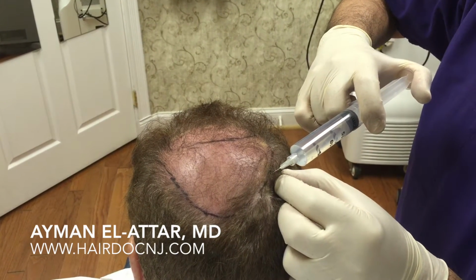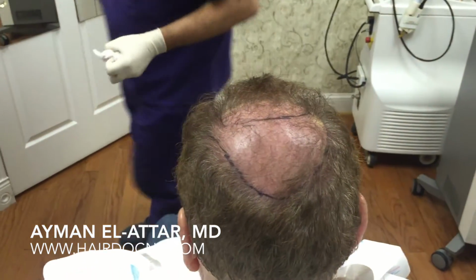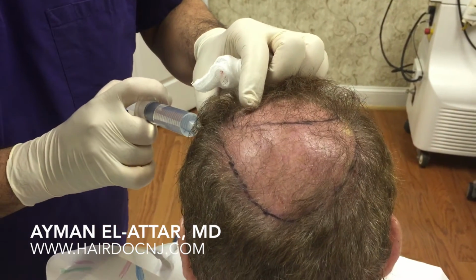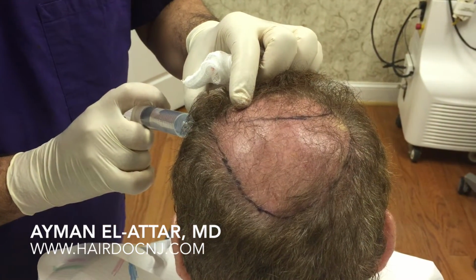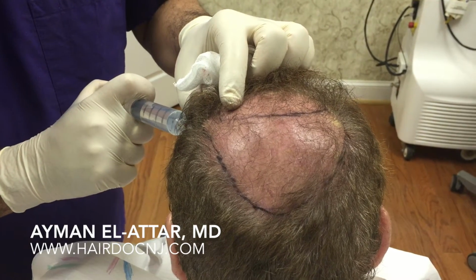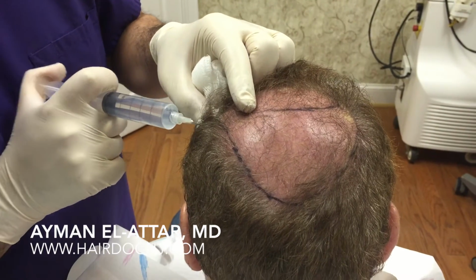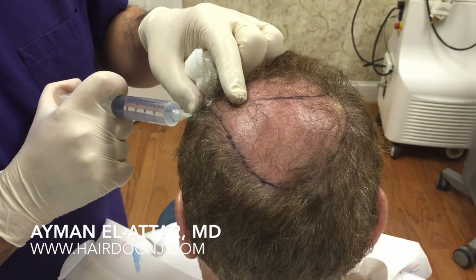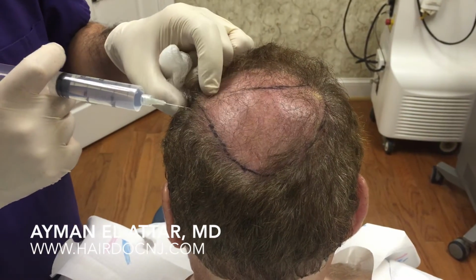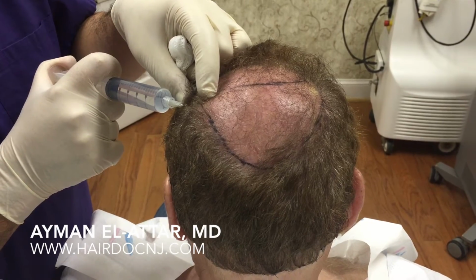Jeff is a wonderful patient. There is no discomfort to this at all. So hopefully your patients will be as good as Jeff as well, and they don't feel much discomfort. We usually do not use any oral sedation in the office procedures. But if you decide to use some sedation, then you have to be in a surgical facility.